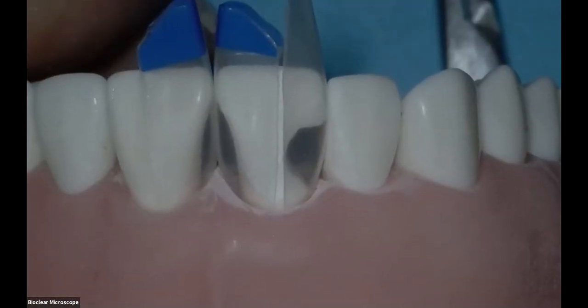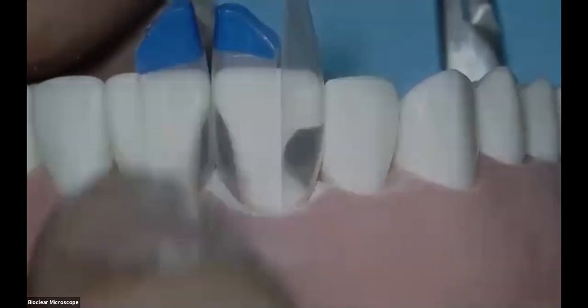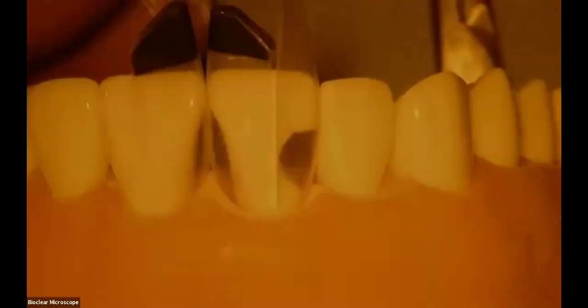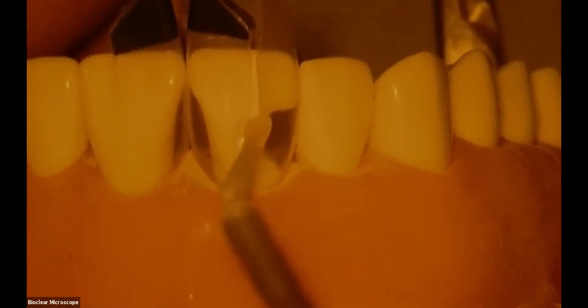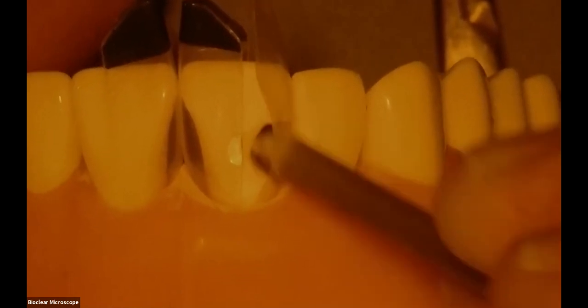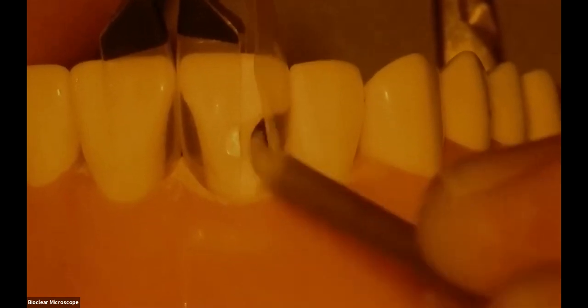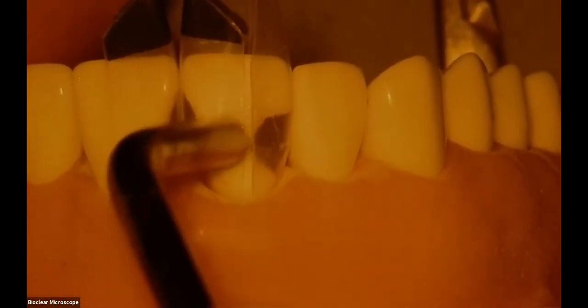So now we're ready for injection molding. So could I have some acid etch? We would acid etch the tooth, rinse and dry, which we're not going to show you today. And then what we do is we massage the Scotch-Bond Universal into the dentin tubules for a full 20 seconds, which is forever. People don't spend enough time doing this. We don't use liners, we don't use Gluma. We just do modern cavity preparations with selective caries retention when appropriate. That's 20 seconds. And then we're going to air thin and light cure.